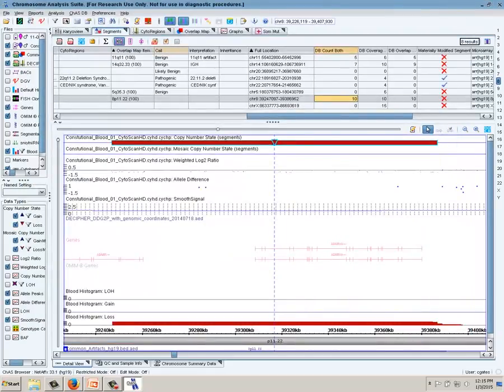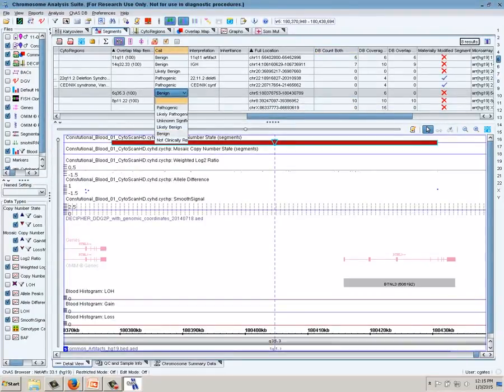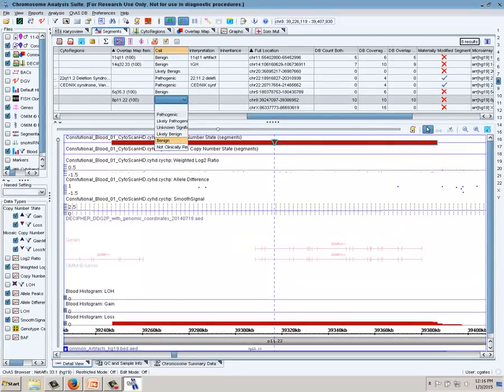Okay, we feel pretty good about that. We're going to call, just click to that. That one was benign. We're going to call this one benign as well, and ATAD3A.